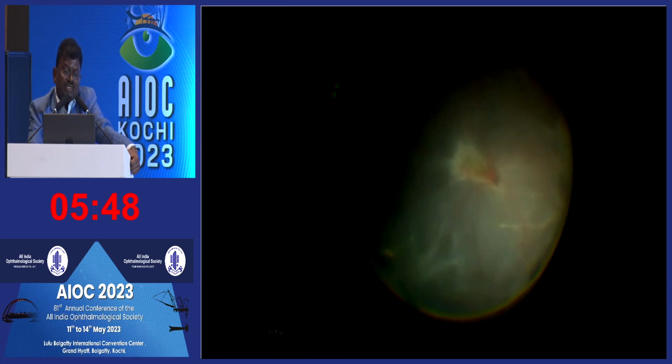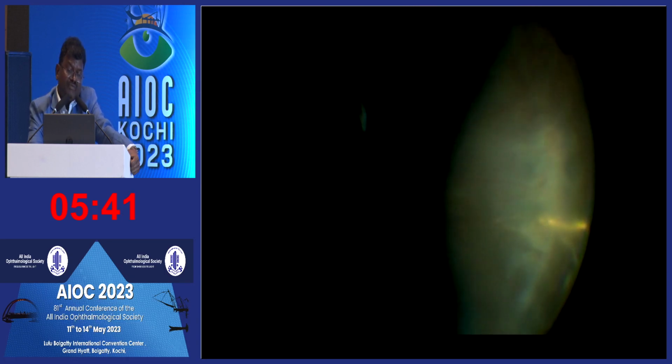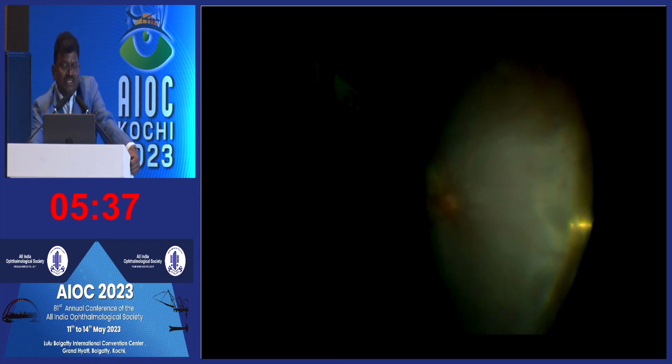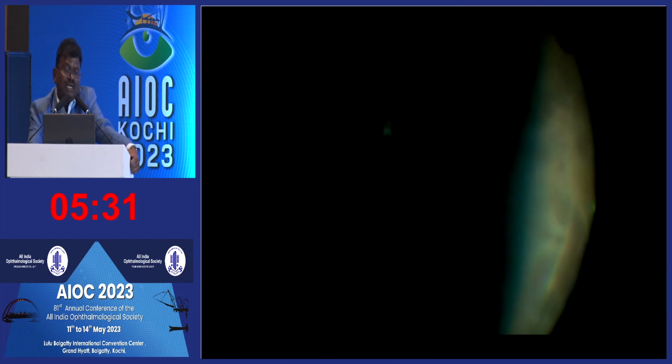So this is the fourth valve port. Finally, we have removed the second band, and there is a napkin ring-like band around the disc, which is also removed. This is the very difficult one when we are removing, because after removing all the subretinal bands meticulously, the final outcome is encouraging. Once this is done, you can now inject the PFCL and settle the retina. The rest of the preretinal PVR bands were removed via the conventional pars plana ports.